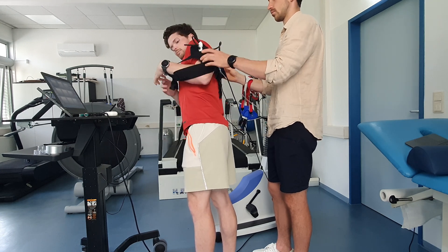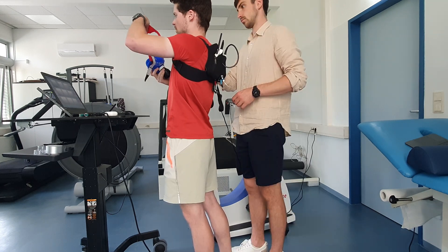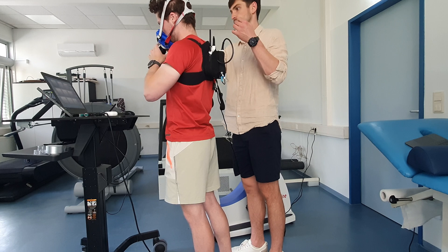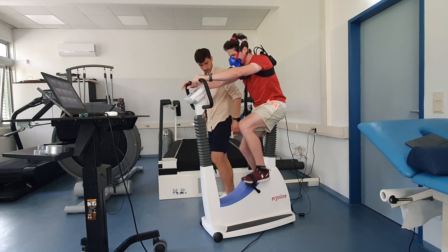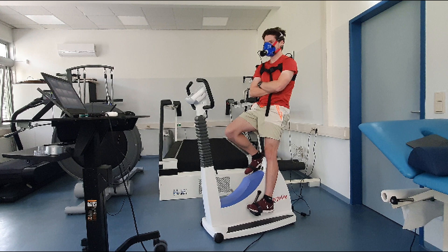The cables face upwards. Now the subject puts on the belt with the wide part at the bottom, then the mask is put on, and it is checked whether all cables and hoses are correctly attached. The test person sits down on the ergometer, the leg straps are fixed, and the height of the seat is also adjusted accordingly. The test person must now sit on the device for three minutes before spiroergometry starts.